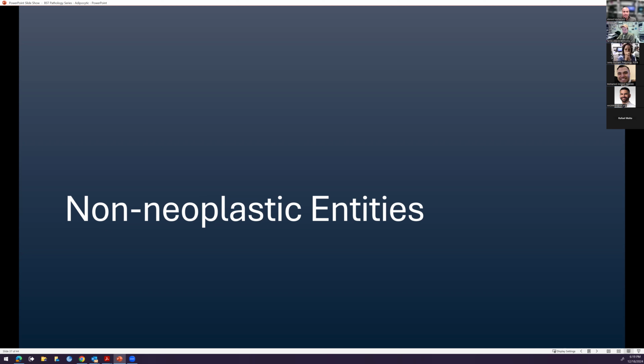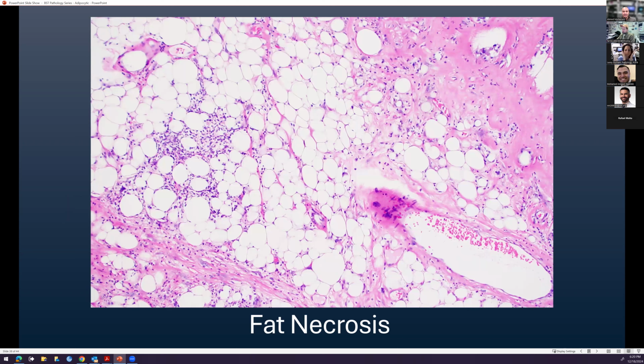This first thing occurs in basically every lipomatous tumor to some degree and is always annoying because it obscures what you're trying to look for, and it's fat necrosis. So always be aware, you're going to see a lot of fat necrosis. In fact, grossly, it may look like a separate nodule. The way you distinguish this is by looking for the infiltrate. It's generally a lymphohistiocytic infiltrate because the fat is leaking out, and so macrophages are coming in to scoop up all the fat. Eventually this will progress to fibrosis and scarring. That's how you start to get a lot of scarring in a lipoma. Okay, that's one thing.